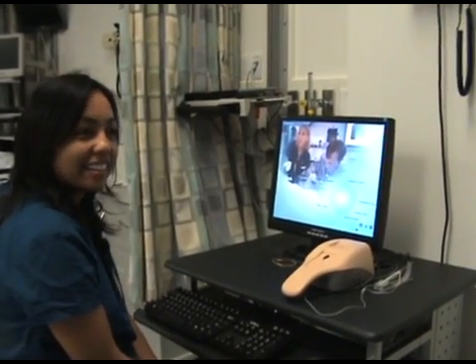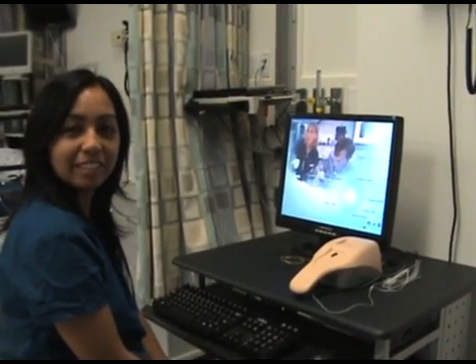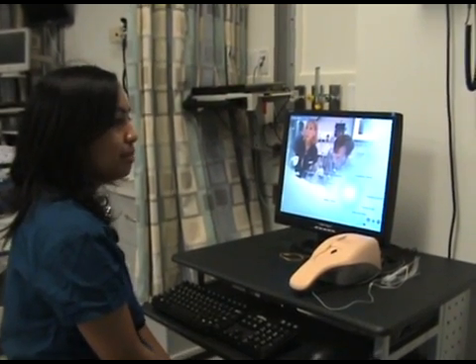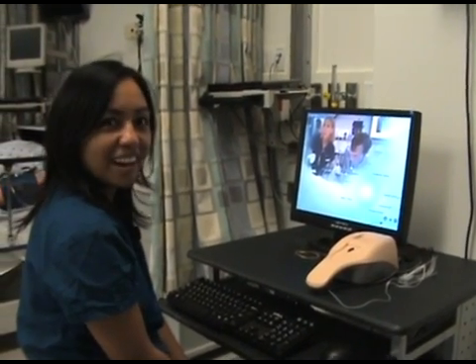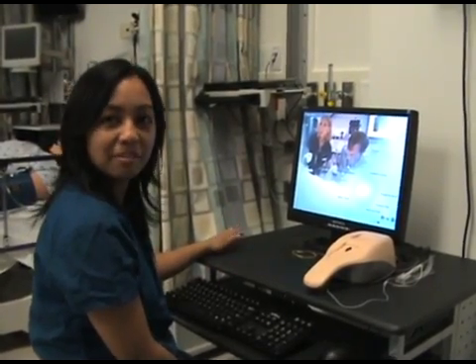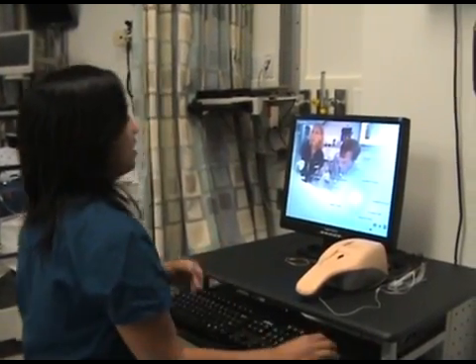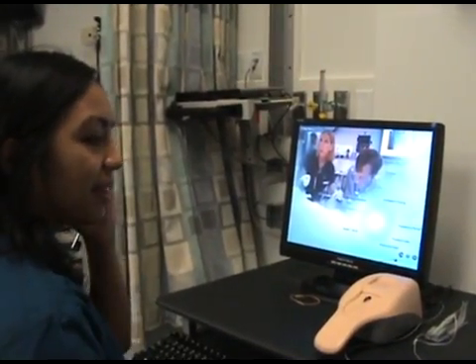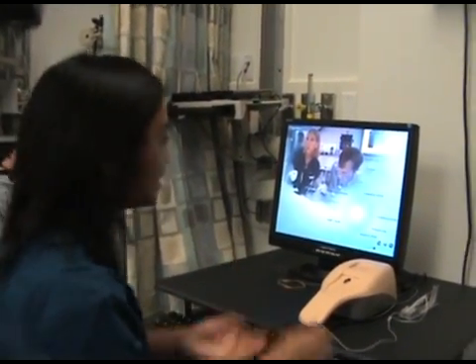Hello, I'm Rachelle Austria. I am an RN currently working in Methodist ER. Today I'm going to be practicing my IV skills using the simulator TW has provided in their lab, and I'll see how it compares to real-life IV skills.